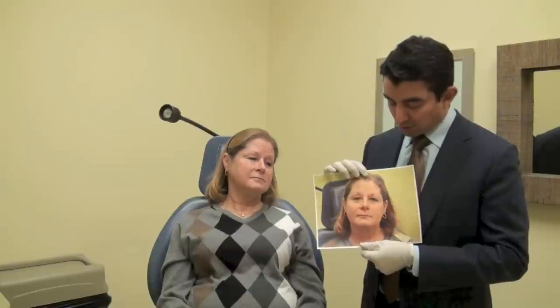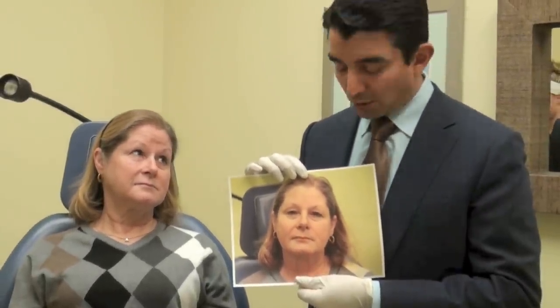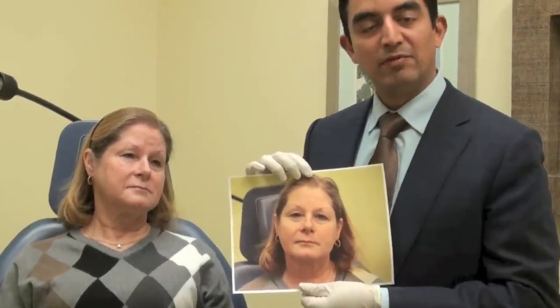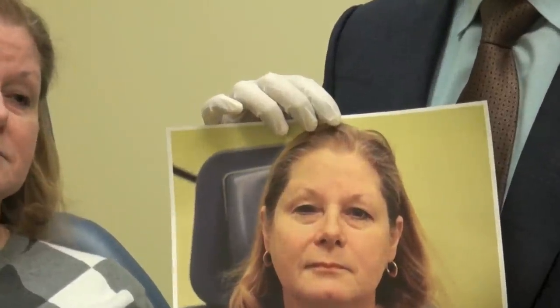Come in close so you can see what her under eye looked like previously. Before we treated her at all, both under eyes are pretty similar — a little bit of a bag, a little bit of a dark circle on each side. Now if we go back to Sandra in real life, you'll see that two minutes ago I treated her right lower lid, and her right lower lid is now ahead of her left. The dark circle is gone and the bag is basically gone.